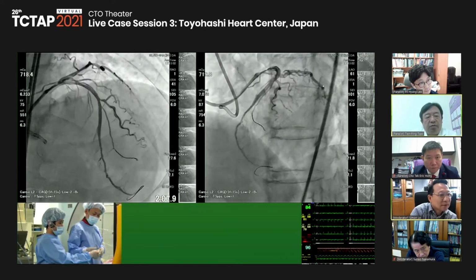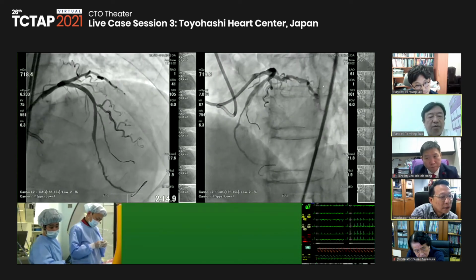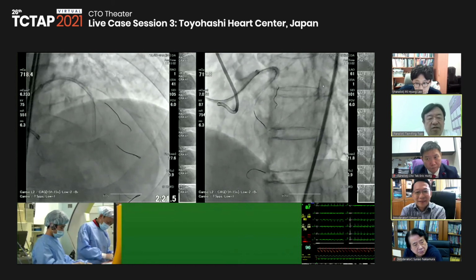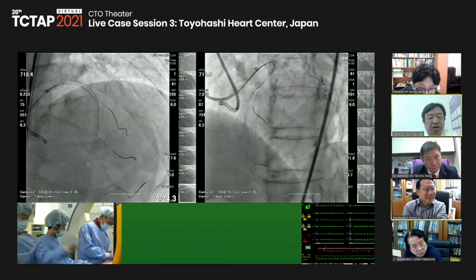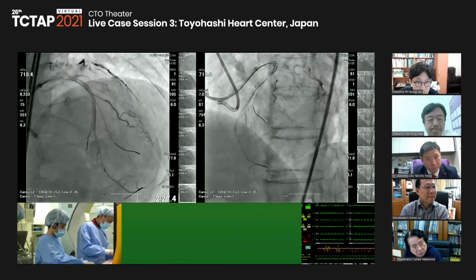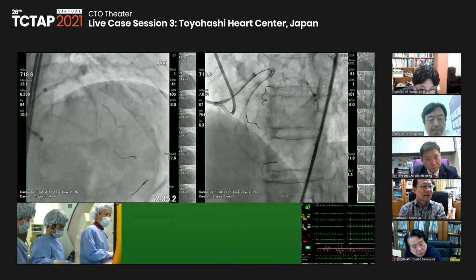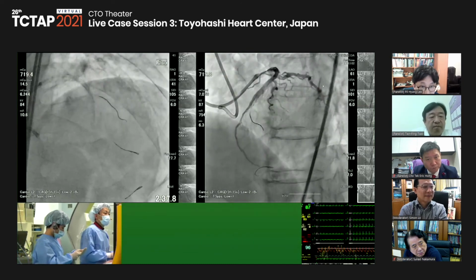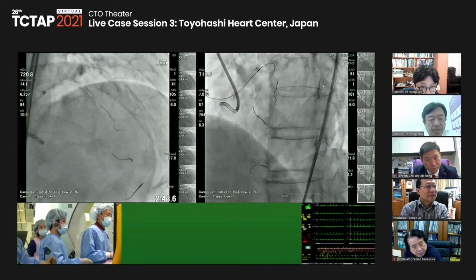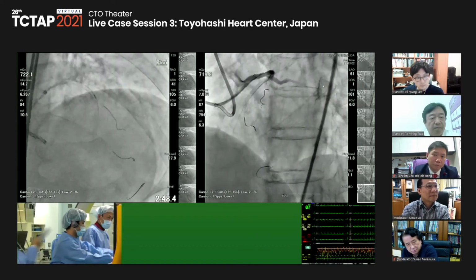So when you implant the stent, you also dilate the side branch balloon, and that's what you usually do, or just like a kissing inflation? Anyway, this diagonal balloon is outside of the stent. The main purpose is that I want to keep the diagonal flow. That's why after stenting, we should select the diagonal branch before the final kissing inflation or the post dilatation.